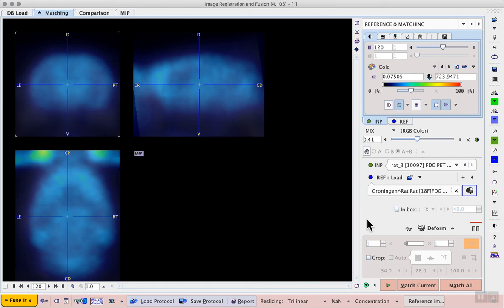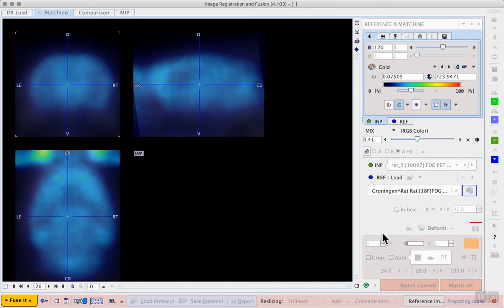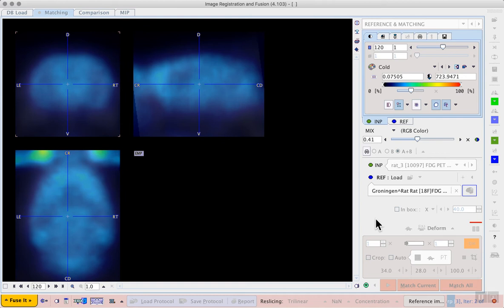Now we can start the deformable matching workflow using the Match Current workflow button. The transformation calculated using this average image will then be used to normalize the dynamic image once we're happy with the result. These calculations could take a couple of minutes depending on the processing power of your computer.